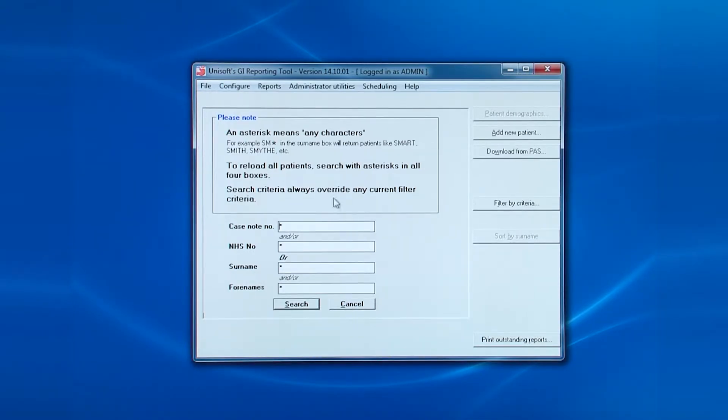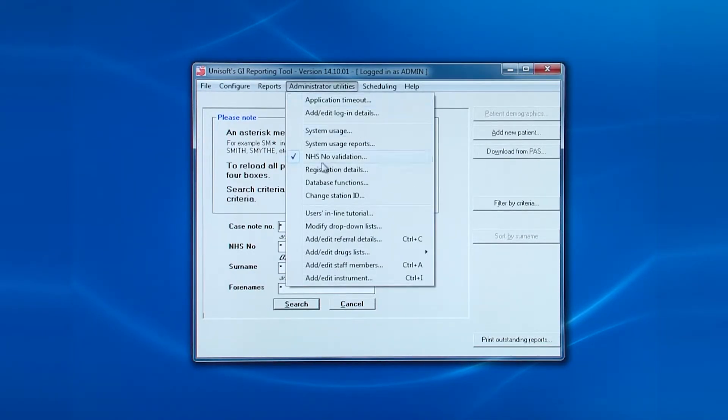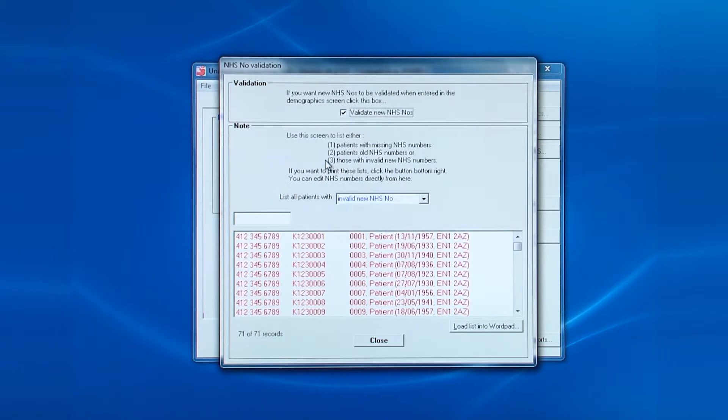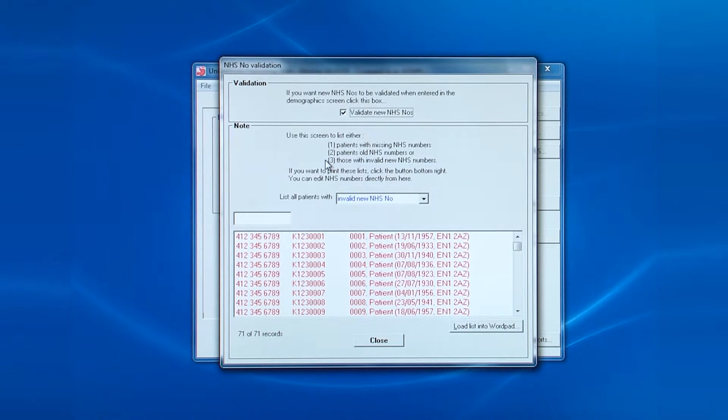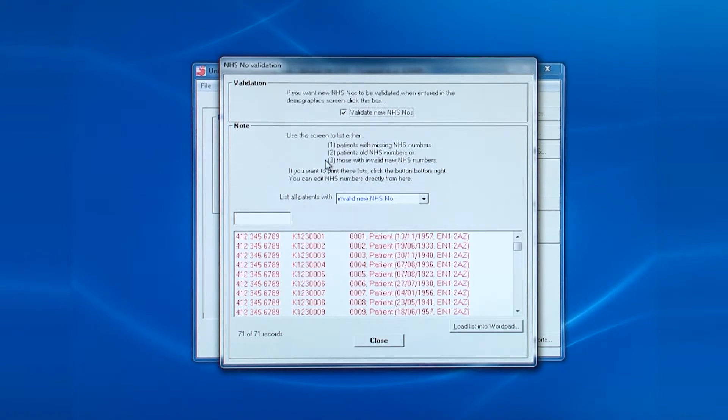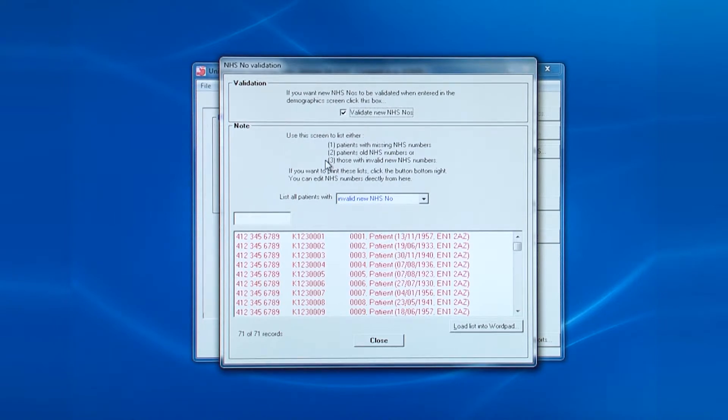The next entry is NHS number validation. This is for those very few hospitals without a PAS interface. It allows you to view and change the details for patients either with invalid, old or missing NHS numbers.